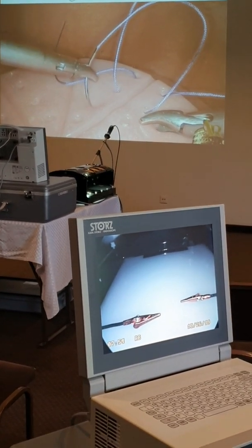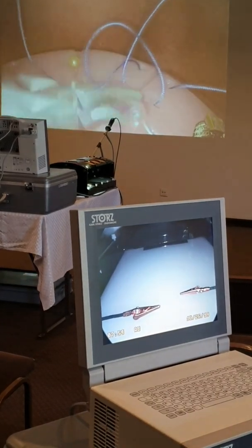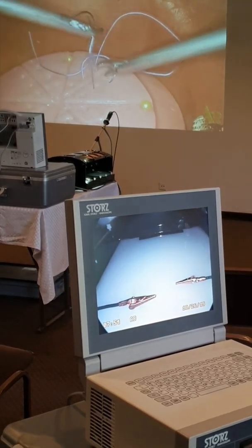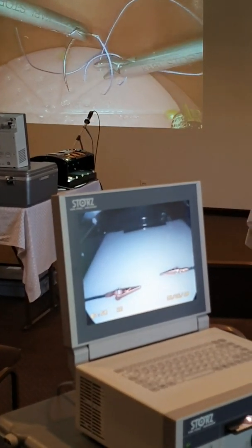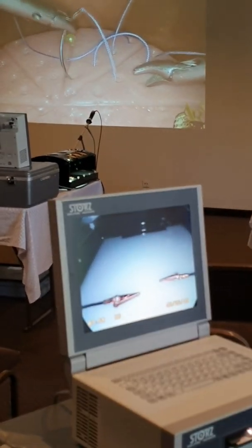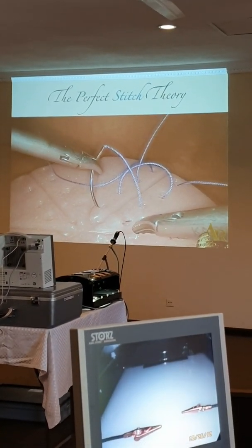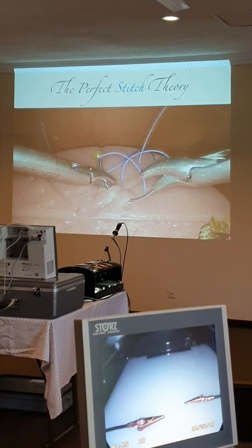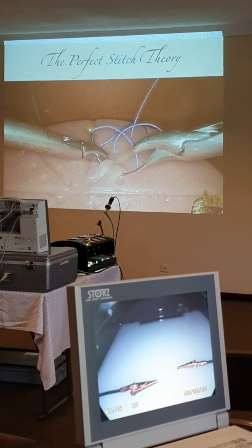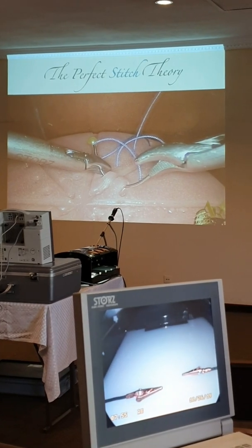So do you see that he's performing with his left hand? And I can guarantee you that his dominant hand is the right hand. So yes, that's what we want you all by tomorrow to be capable of. Do you think in this condition, look, both hands, the right hand and left hand, in this orientation of the wound, he could perform the suturing with his right hand?